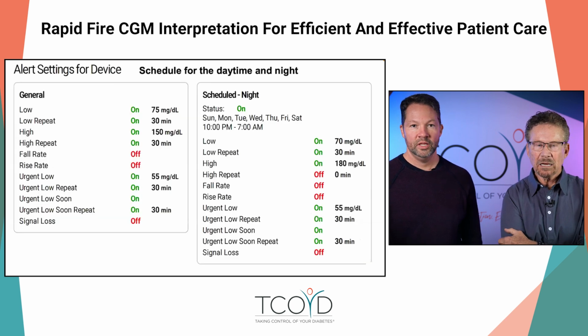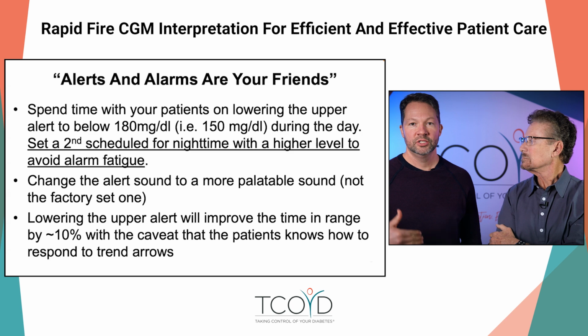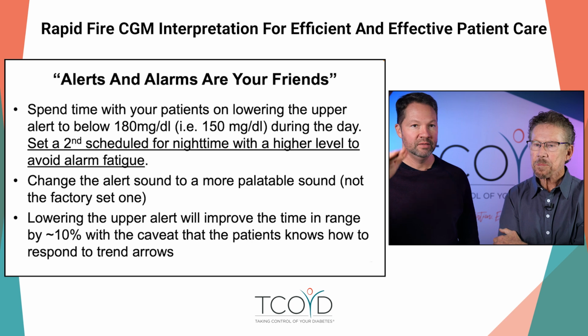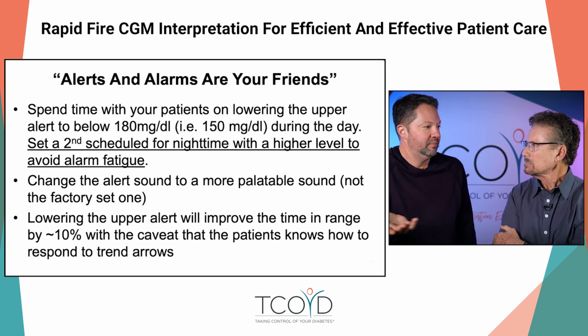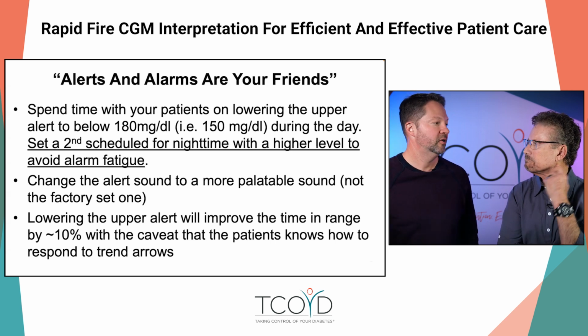And this is just... Well, I think, if I can, yeah, it's a great suggestion. And I think it's important you say the first thing, spend time with your patients. So that last patient who had it set at 370, it's not like you'd say set it at 150 now. Over time, you would get them kind of accustomed to it, bring it down. The default is usually 180, but I agree that's generally too high. So, let's try 170, let's try 160, let's try 150, and kind of tighten it over time.